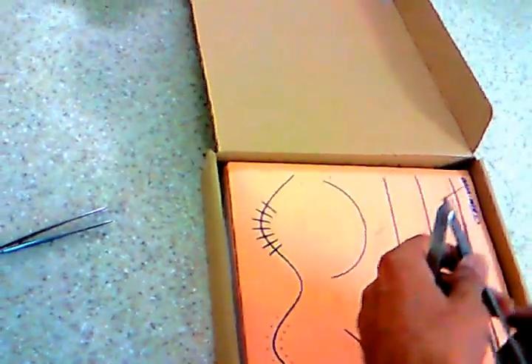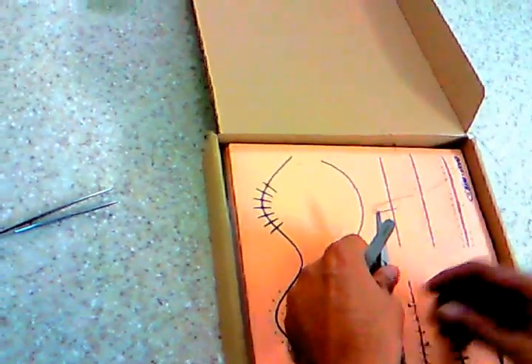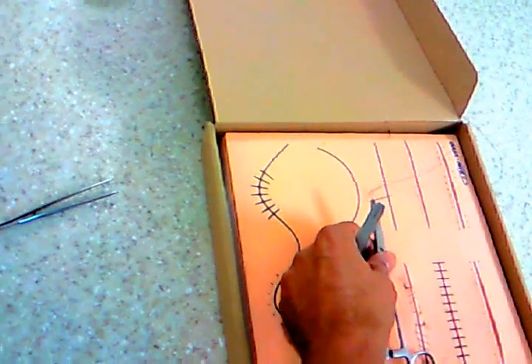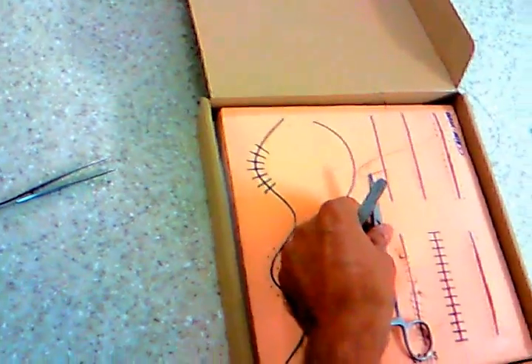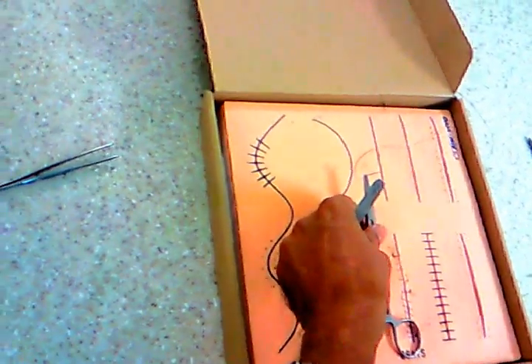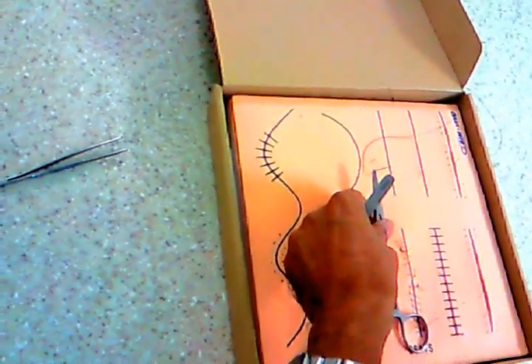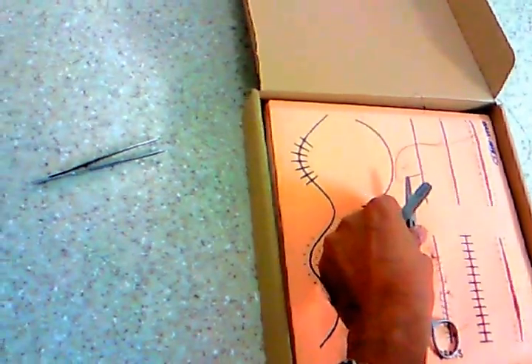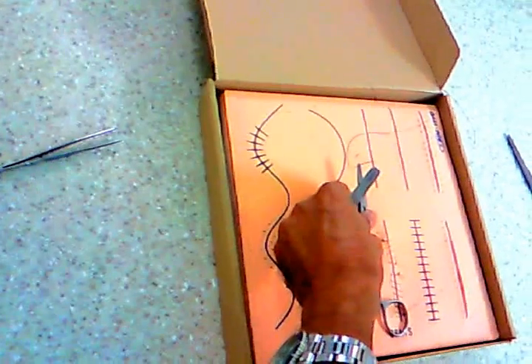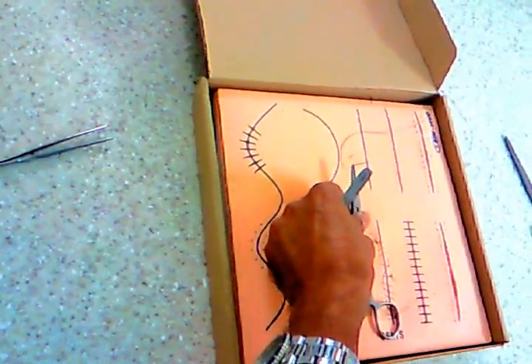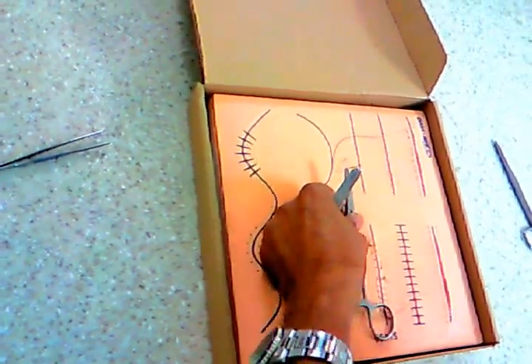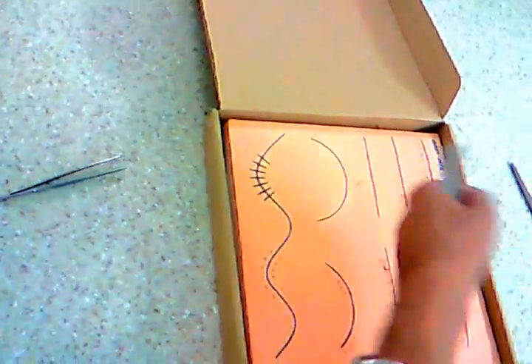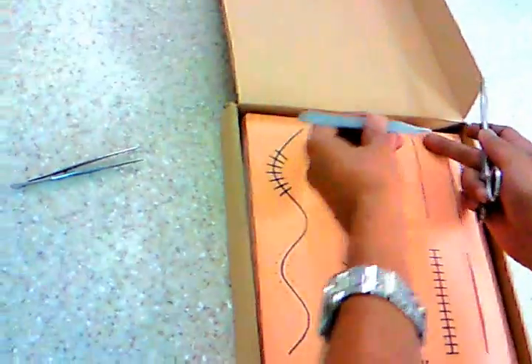This is done when we want to get very good apposition of the skin, dermis to dermis separately, and epidermis to epidermis separately. And this gives a very good scar.